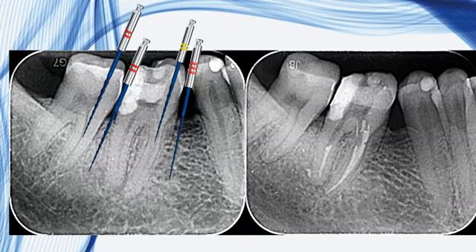Here you can see the obturation, you can see the lateral canal on the distal, and both mesial canals filled. One thing, these mesial canals were filled with a gutta percha 25 4% point. They do not always match your master file, so you have to be careful with that. You can finish with a small apical preparation, but sometimes, depending on the brand, your fitting cone is going to be another one, a bigger one.